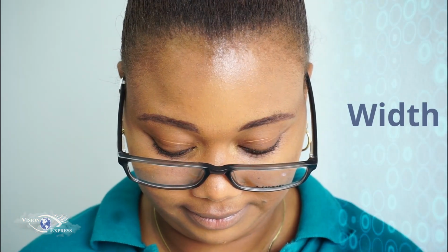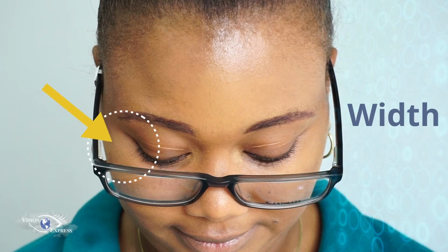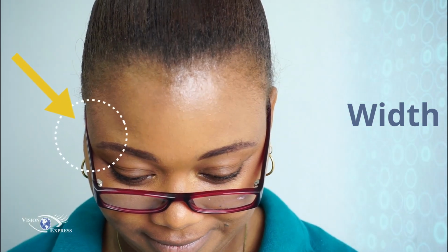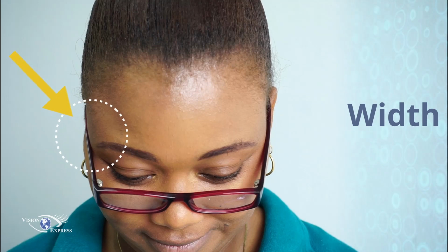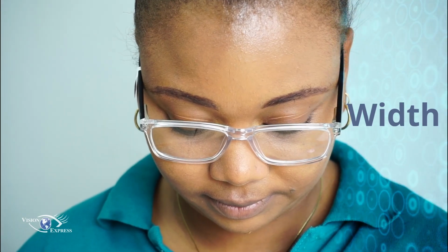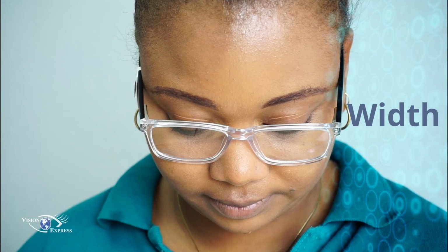The width. The frame should not be too wide across the patient's face. If 2 or more fingers can fit between the patient's face and the frame, then it is too wide. Also, if the frame is too narrow, the temple should not press into the patient's face, leaving a dent. The ideal fit is that the temple lightly touches the patient's face without dropping if the patient tilts their head downward.